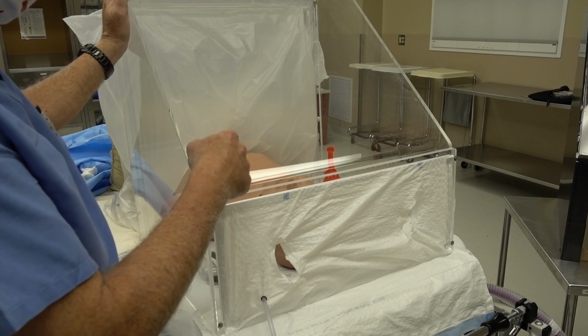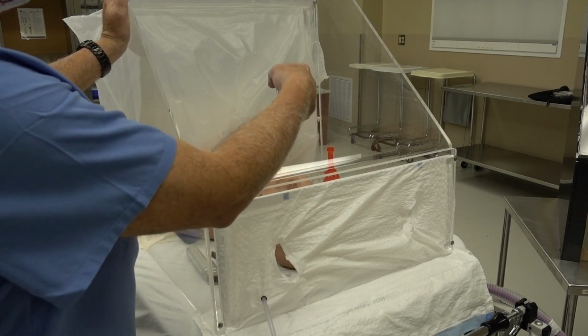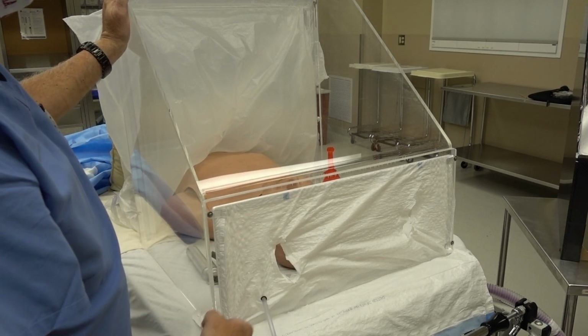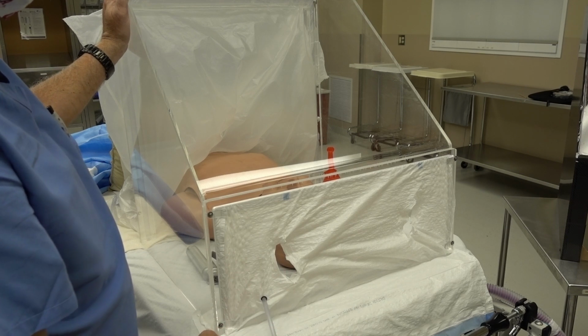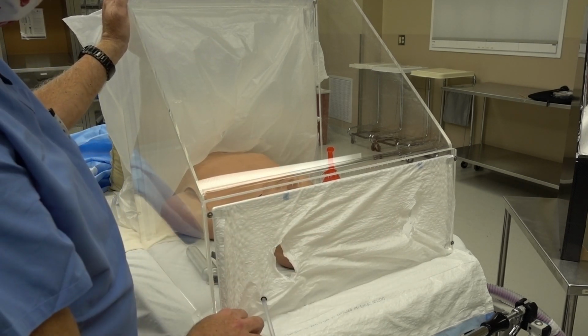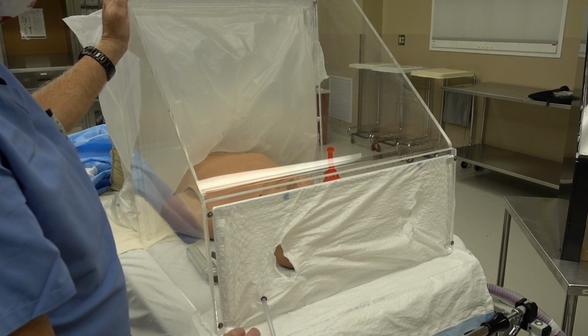Again, when you use a chamber, you want everything in it before you start. And again, an assistant can reach in through the bottom and assist. But we wanted a totally closed system instead of having an opening in the back or ports that are solid that are open, to try to keep the viral load in the room as low as possible.